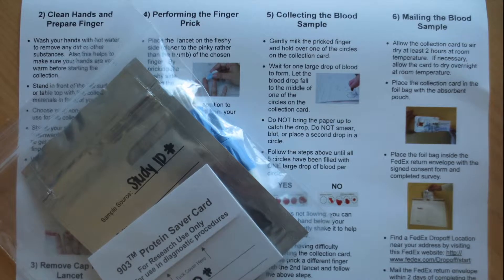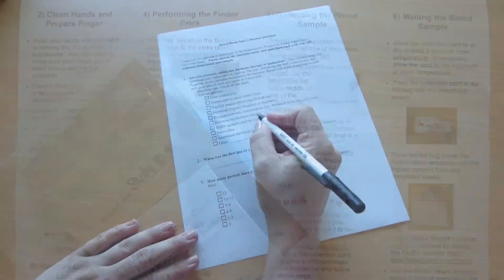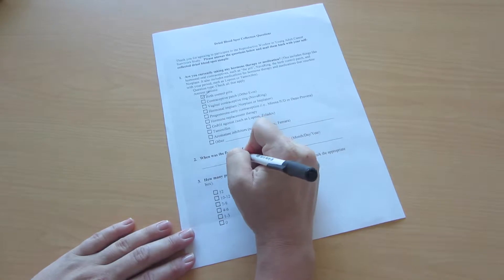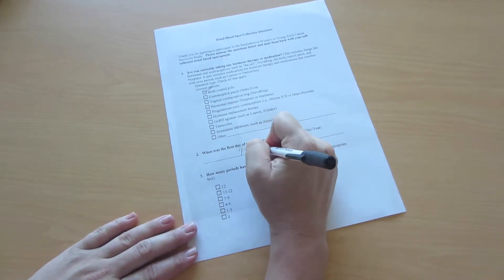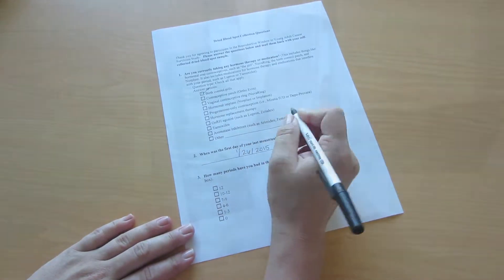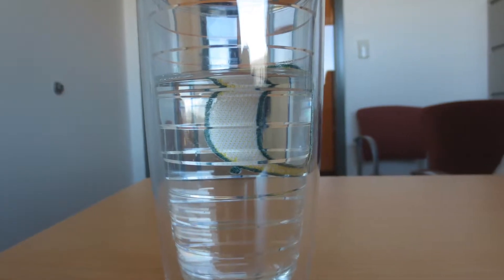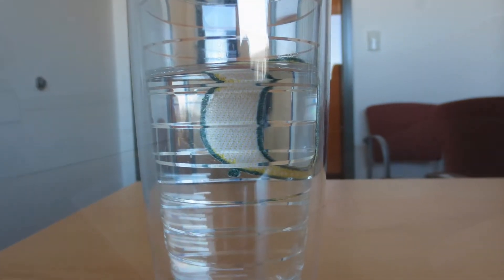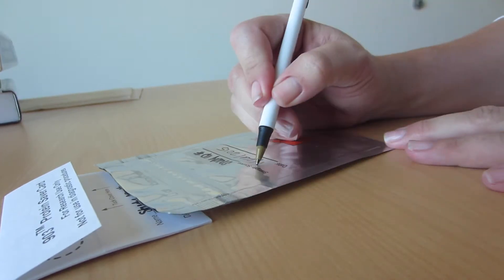There are a few key steps that you will need to complete before you collect your sample. First, answer the survey questions that were included in your packet. Then, drink a full glass of water. Write the date of collection on the collection card and foil bag.